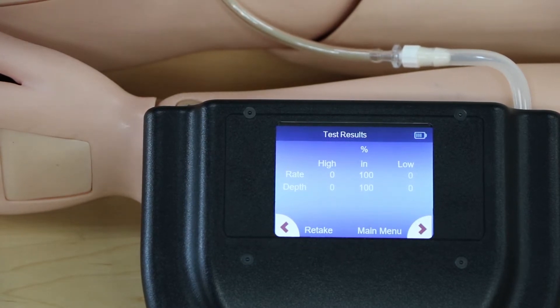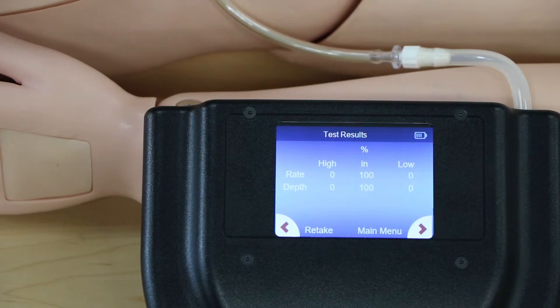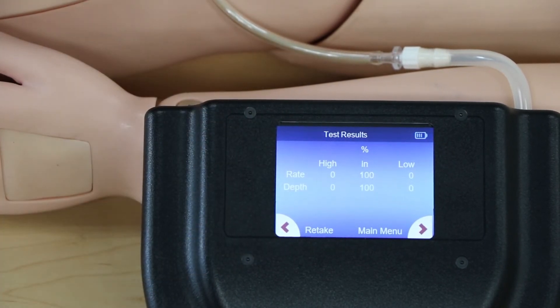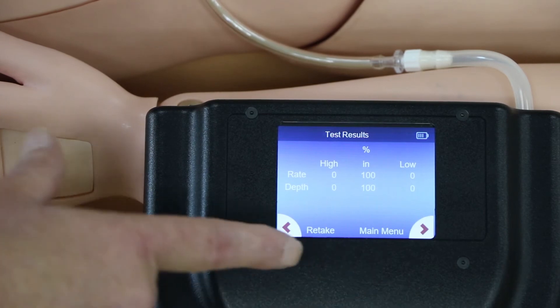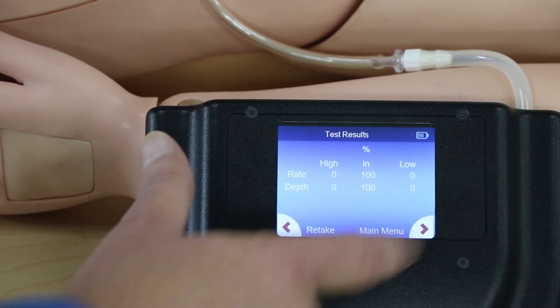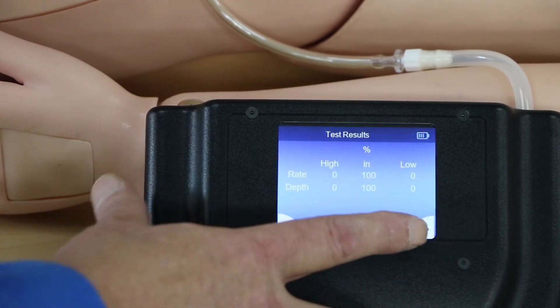After you're done with the test, the test results screen shows and it shows you the percentage that was in range, the percentage that would be too low, and the percentage that would be too high. Top lines are for the rate, bottom lines are for the depth. From here, you can retake the test if you didn't like your results, or hit main menu to go back to the main student screen.